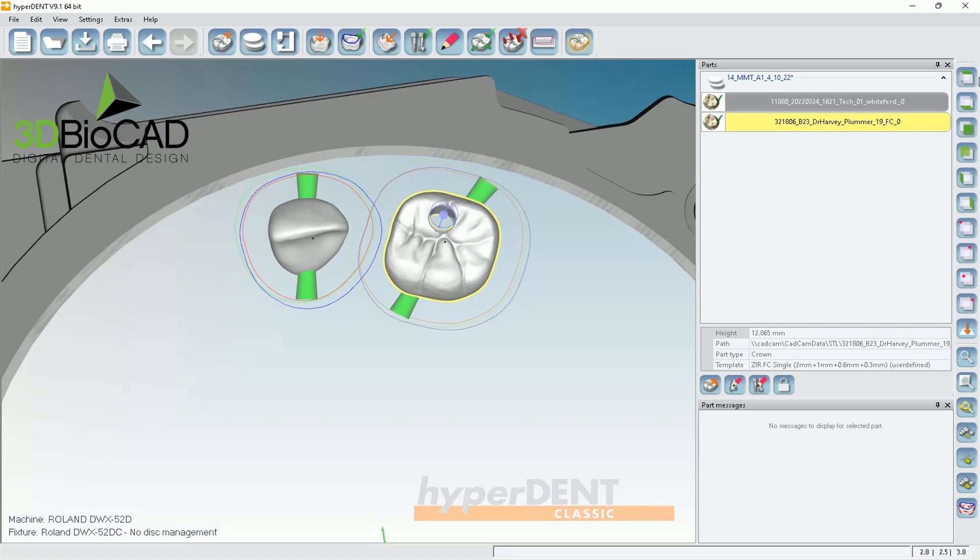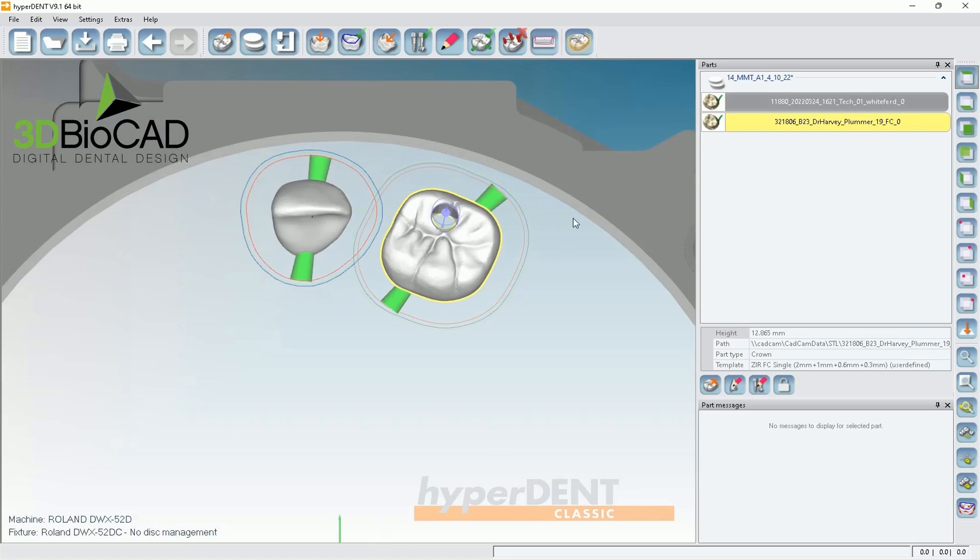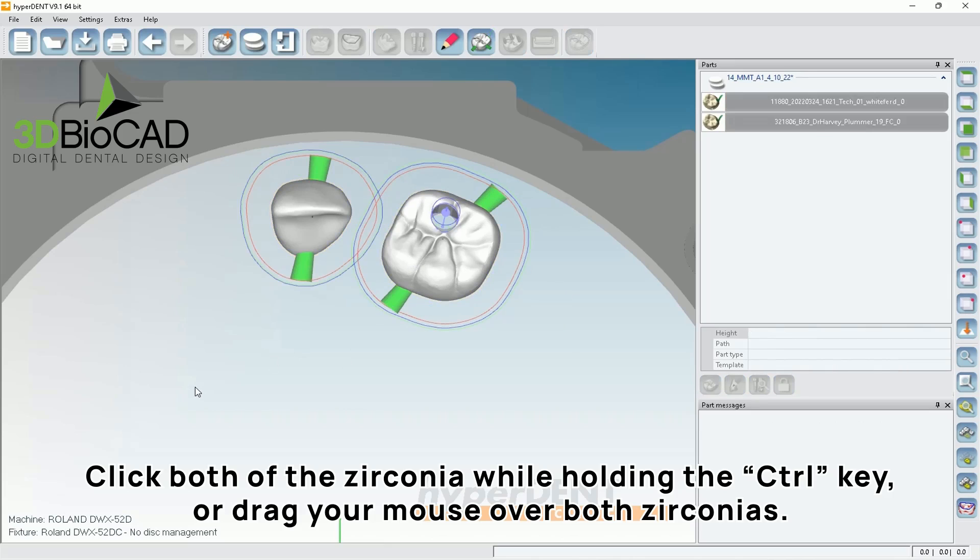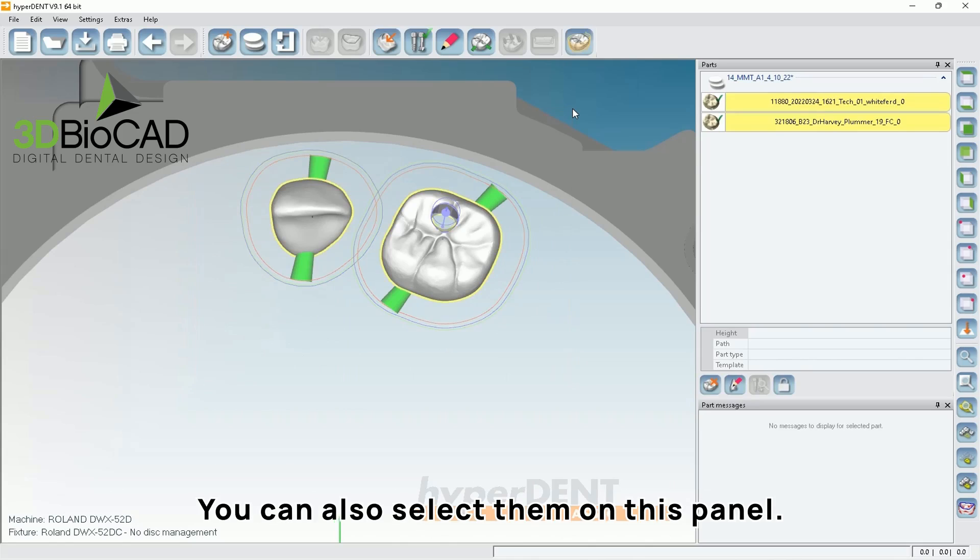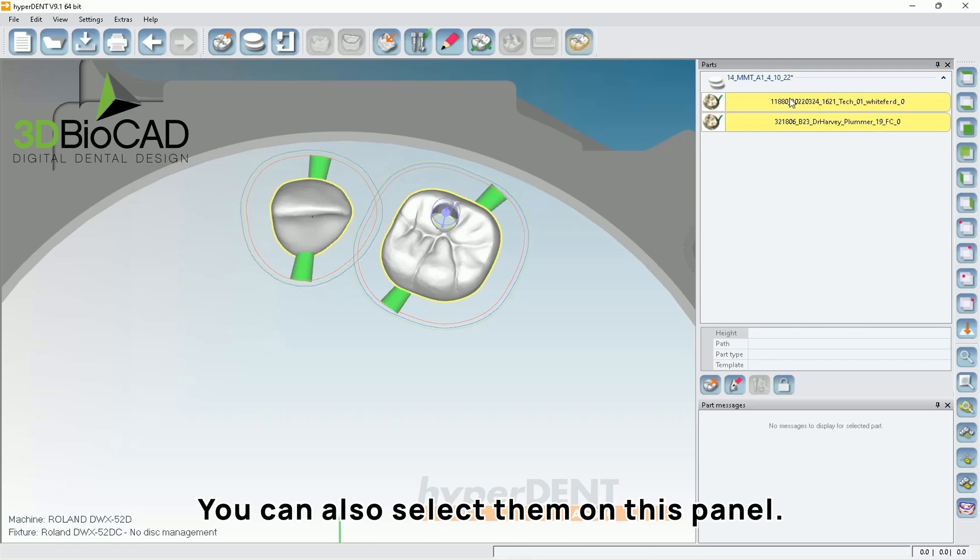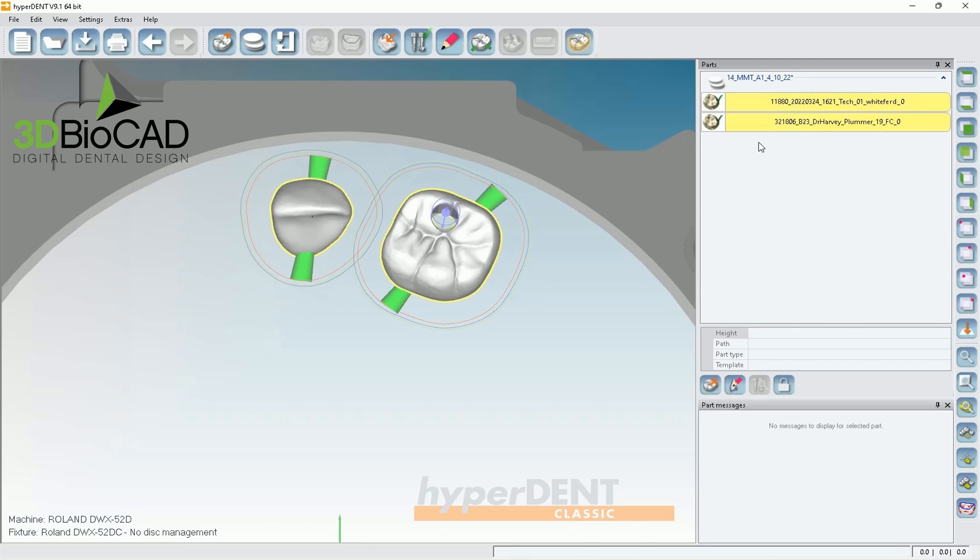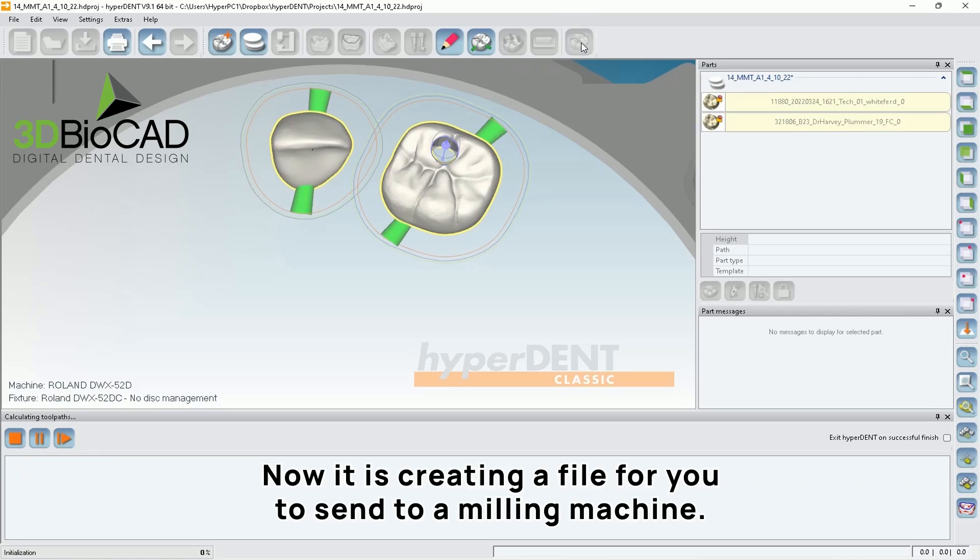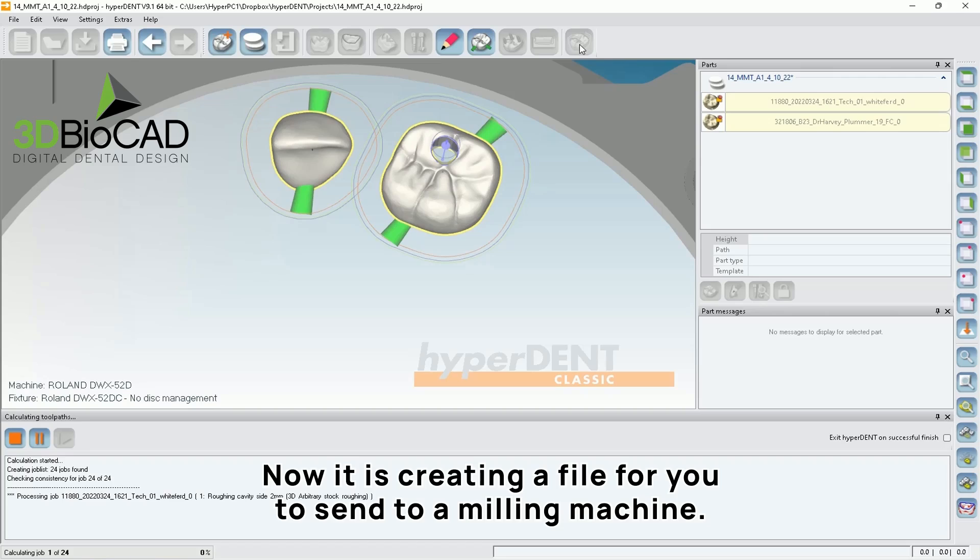And when you have more than one crown, basically you have to select both of them. So I click this and then click control and click the other one. Or you can just drag the mouse and select all of them. Or you can just select from this here. Just click all of them. Then you're able to calculate. And be able to prepare a file for you to be able to send it to Roland. And the Roland will start the job and milling those two restorations.